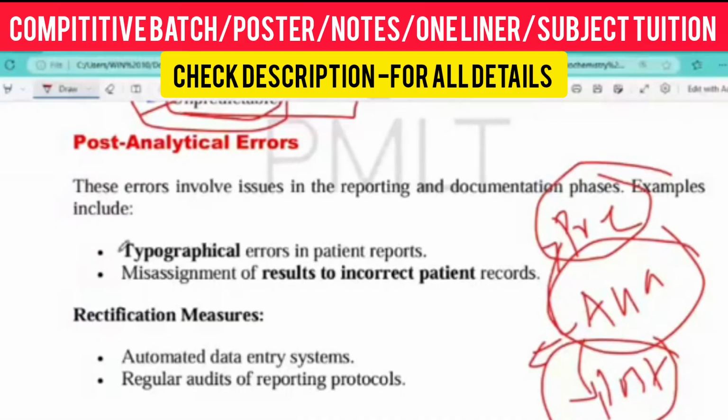See, typographical error. Typographical error means after completing the test, whenever you are writing the wrong report for this particular patient, for example, sugar is 140 milligram per deciliter, but you mistakenly type 100 mg per dL.